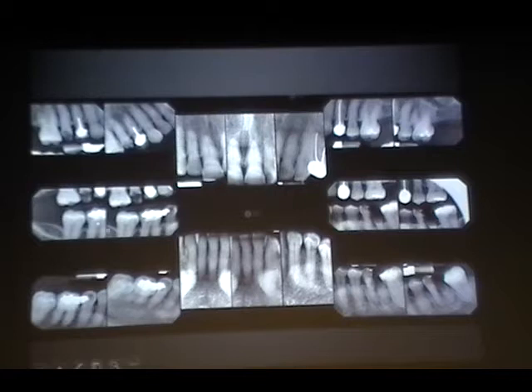We'll start from this. You have 15 seconds. I'm missing the apices. We're missing the second molar.